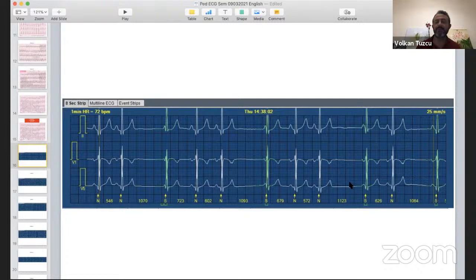So why does this patient have sinus pause? Some of you said maybe it's sinoatrial exit block, right? What is the other possibility? A few of you mentioned sinus, I mean, a form of, again, could be sinus exit block. All right, as some of you mentioned already, just for the sake of time, we have 12 minutes to finish.